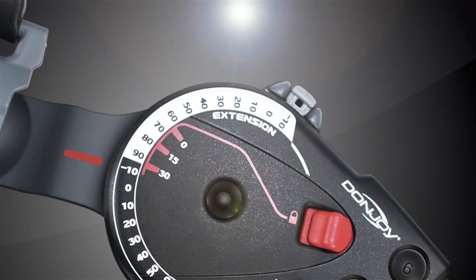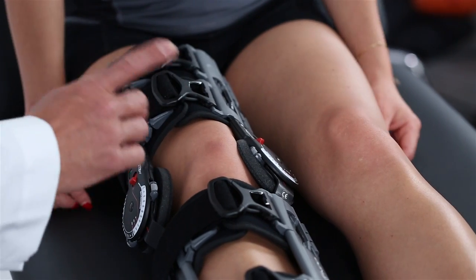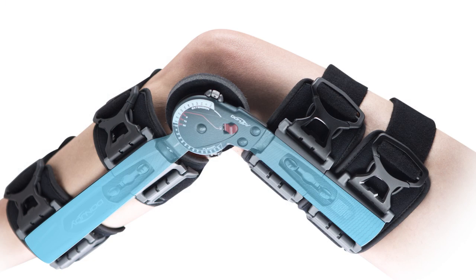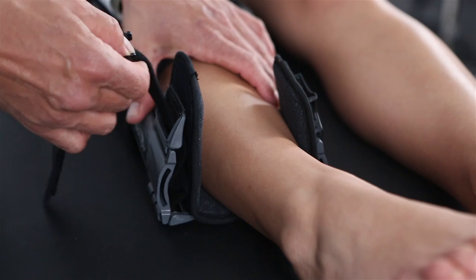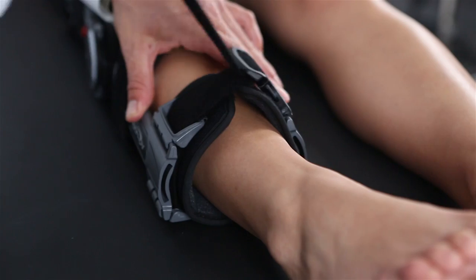In some cases, it may be necessary to troubleshoot the Exact ROM. For example, if the hinge moves forward on the knee, unbuckle the straps and make sure the uprights are midline on each side of the leg. Then pull the slack out of the straps on the backside of the leg. Snap the buckle in and fasten the Velcro strap end down.